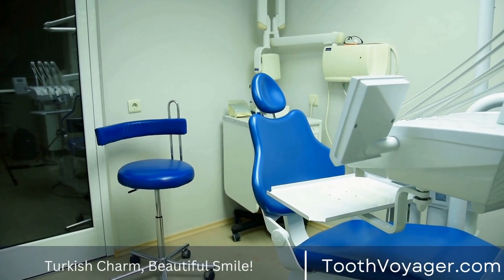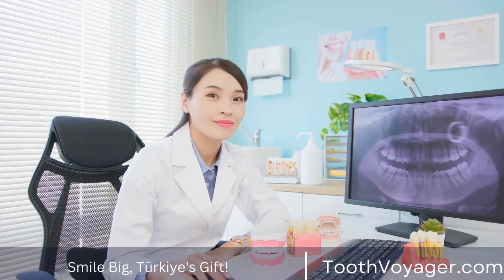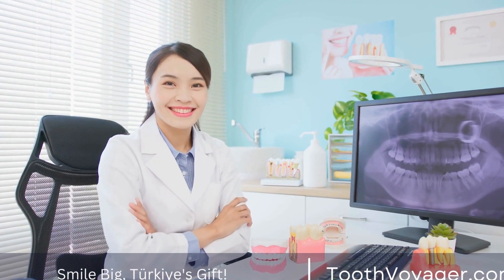Polishing: The final step in crafting a dental crown is polishing. This is done to smooth out any rough edges and ensure the crown blends seamlessly with the natural teeth.